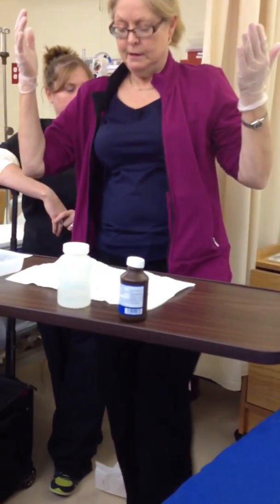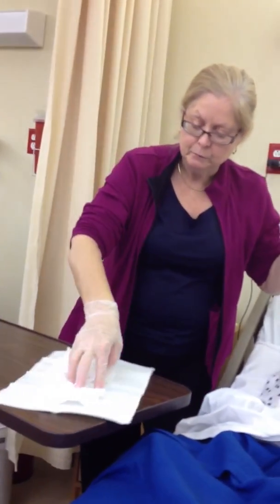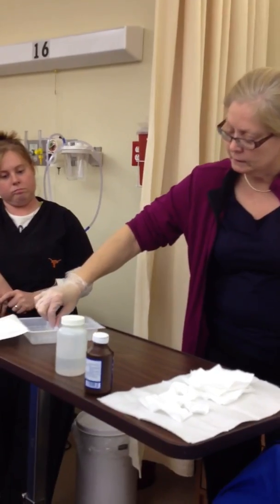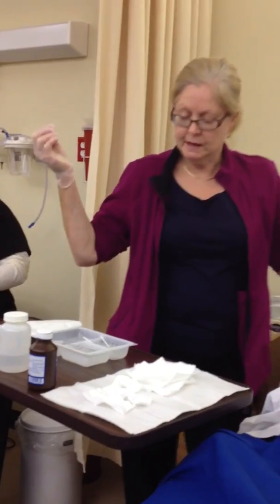Okay, now my tray is still not exactly where I want it to be. I really need it to be over here on this end. So I'm going to use my feet and turn everything around, and it should be closer to me so I don't have to go very far. And remember, I'm still sterile, so I can move this over here, and I can move this even closer too. Now, before I make this hand unsterile, I'm just resurveying, and I'm happy with everything.